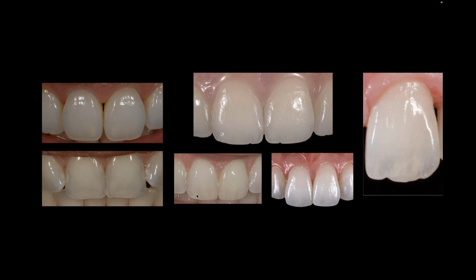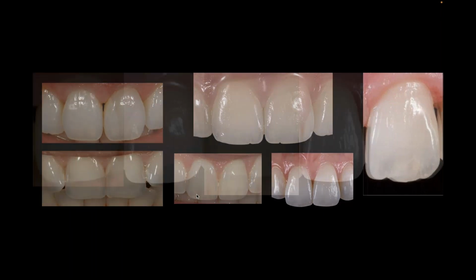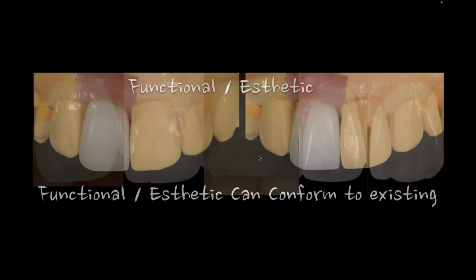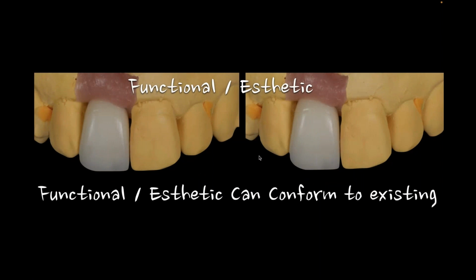So the point is you can't just have a standard formulation every time we're trying to create an incisal edge. It really has to be pertinent to the patient that you're working on. And each time I do it, I'm really trying to think through what are the effects that I need to achieve in this area. And realistically, I have to be somewhat conformative in smaller cases. So if I'm doing a single central, if I'm doing 2 units for that matter, or even 4, I'm really working conformatively. I'm really working to match what I see in the teeth already.